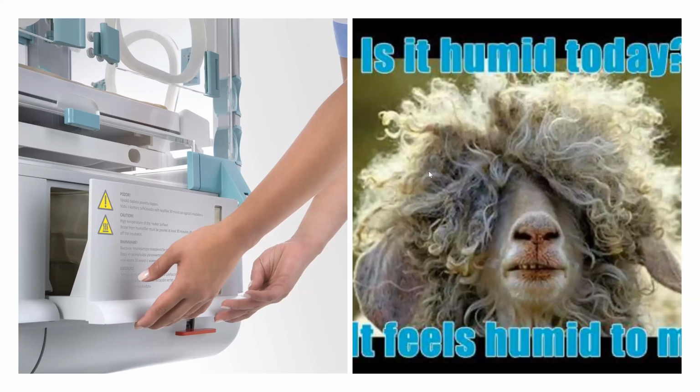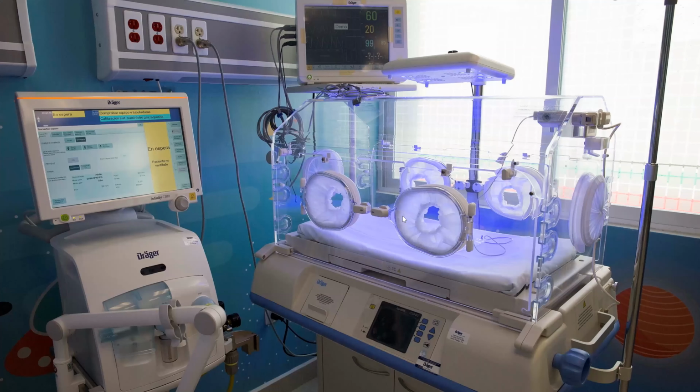The other thing I wanted to show some of you are these porthole covers. Who remembers porthole covers? The most disgusting fomites of all time. Because we wanted to keep all that humidity we had just generated inside, we'd have to change these porthole covers. It was a pain to put them on and a pain to take them off. Yes, absolutely. So we've come a long way in how we manage these little ones today.